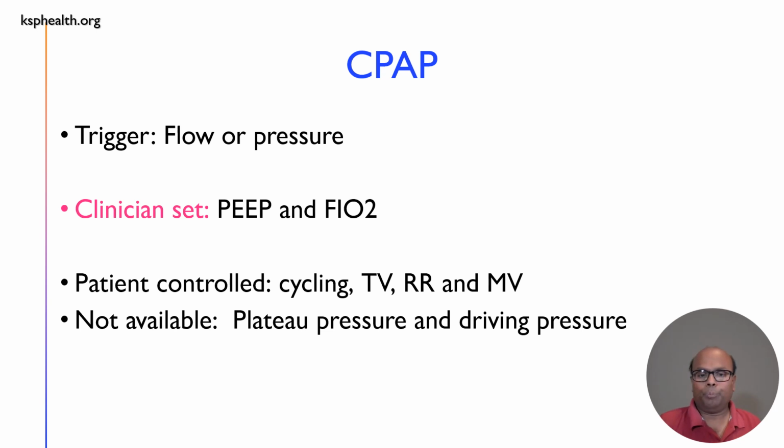And CPAP mode. CPAP modes I often use for weaning purposes, but it can be used in acute cardiogenic pulmonary edema, the post-op period, and so on and so forth. The clinician sets PEEP and FiO2, and the patient controls tidal volume, respiratory rate, and minute ventilation.